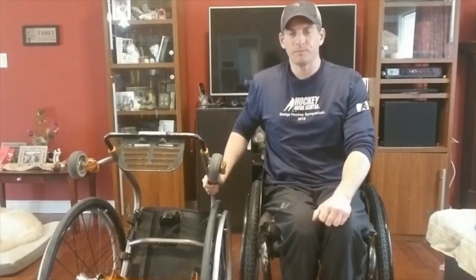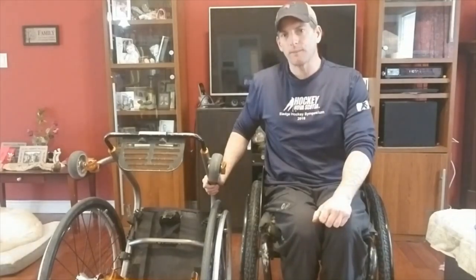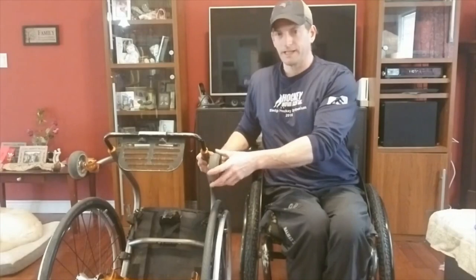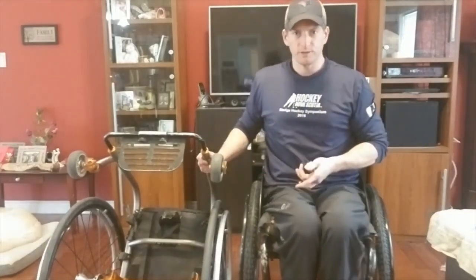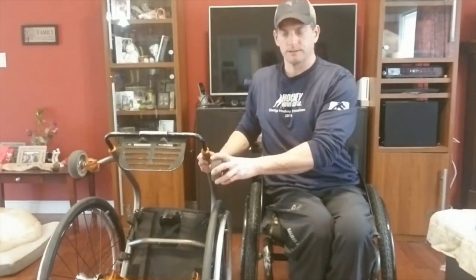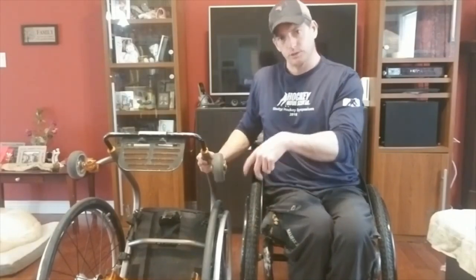Hey everybody! Shane here from Paralife TV and in this episode I'm going to change out my front caster wheels out of my Tidelight ZRA wheelchair. I'm going to show you the tools that I use, I'm going to show you how I clean them, and just basically replace the wheel today — taking the front casters out, putting new ones back in.